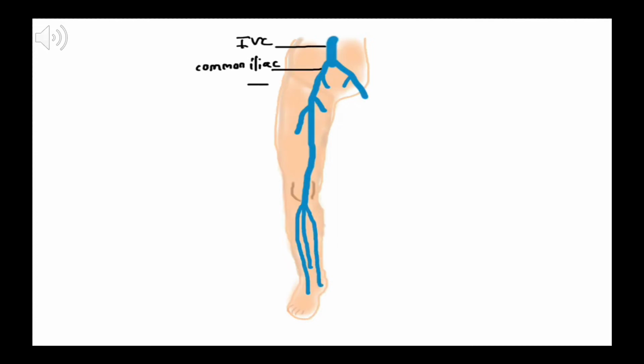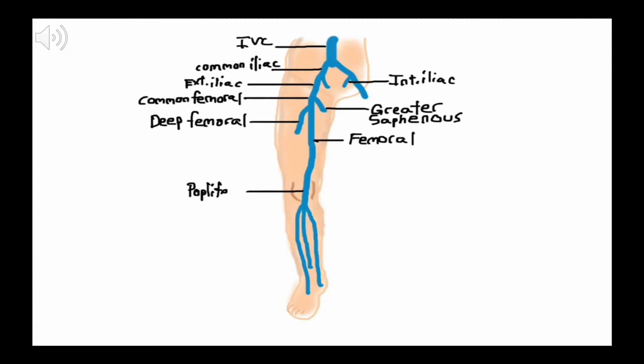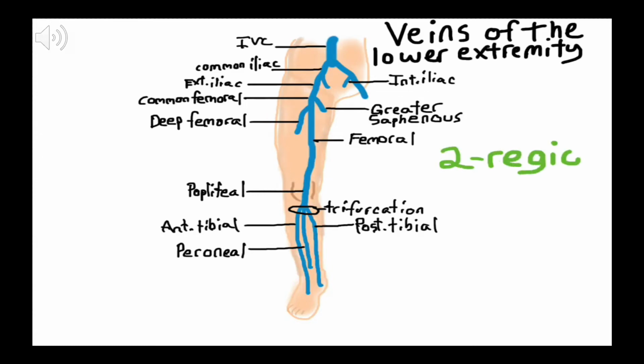Point-of-care ultrasound has started to gain traction, with a large literature basis demonstrating potential for highly specific and moderately sensitive results. The anatomy of the leg that is most at risk for DVT is the areas of high turbulence and the potential for agitation of blood, causing platelet activation and forming a clot. These areas are at the branch points. For the sake of discussion, we're going to focus on a two-zone compression technique and review its limitations and uses.